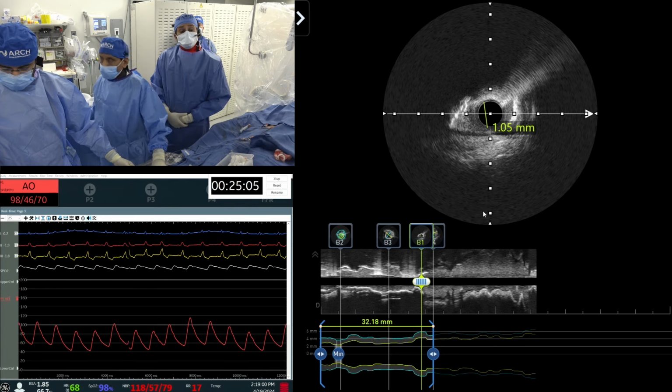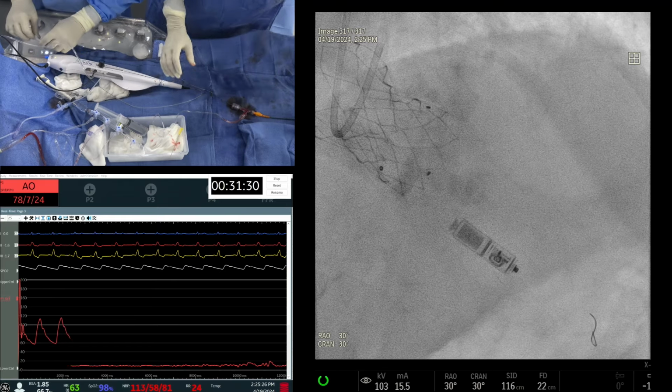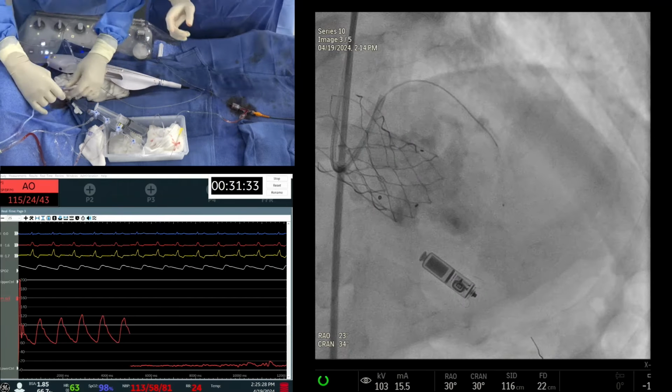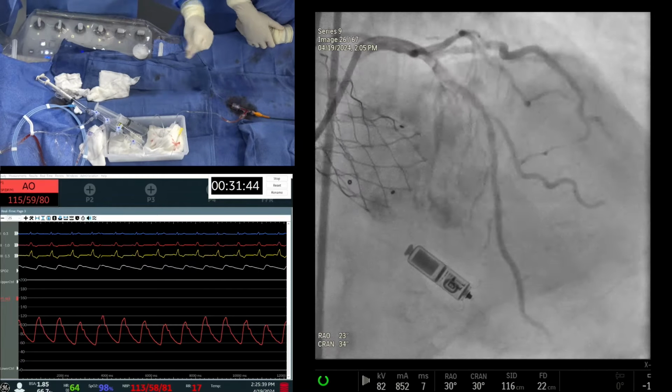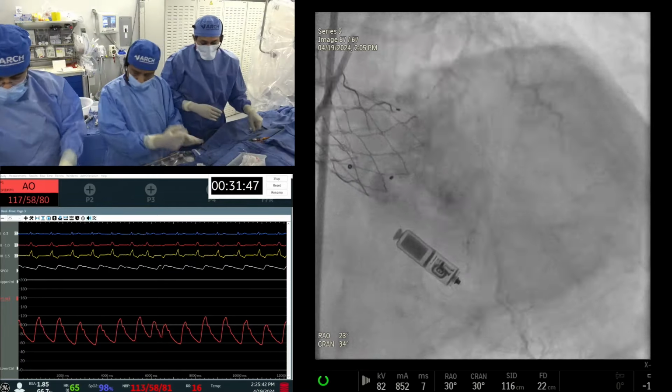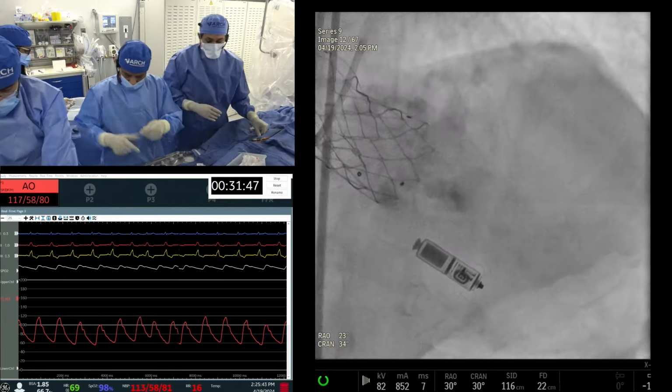I mean, that's the safest way to do it, right? Anu, is that what you guys are thinking? Lithotripsy in the diagonal? But also another question: is this actually the safest approach for the diagonal? Look at the angle. It's an acute angle, safer than if you have an obtuse angle of the side branch. If you want to do rotational atherectomy, this diagonal ostium is not a bad ostium where we think we can do rotational atherectomy. But right now what we'll do is we'll wire the LAD quickly and then go to the side branch.